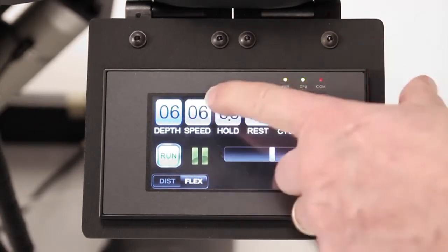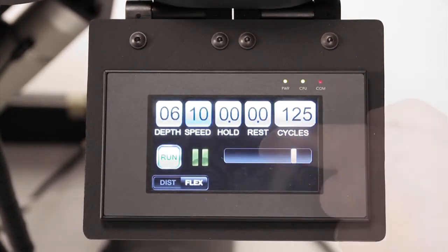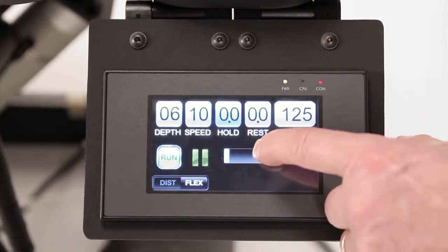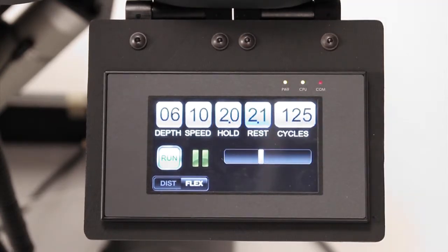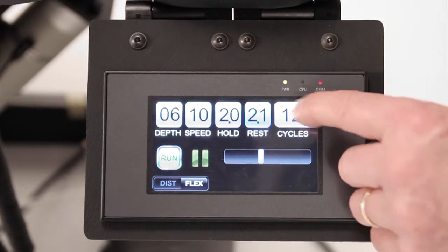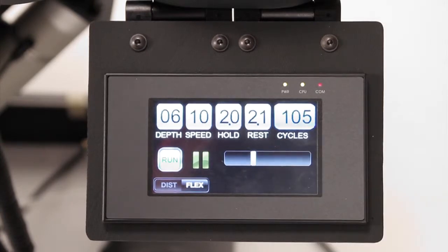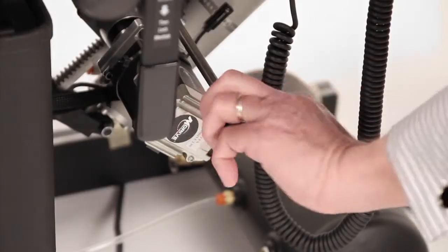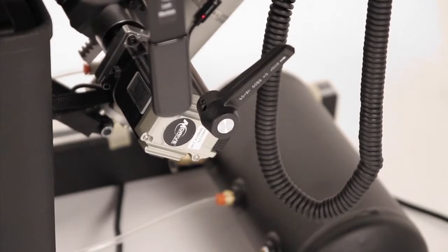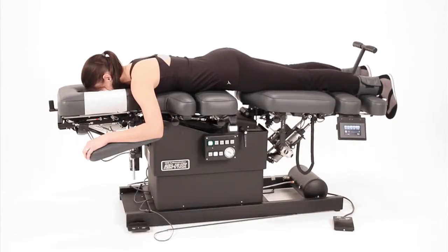Use the touchscreen to adjust your desired settings for flexion depth, speed, flexion hold time, and rest time. You can also adjust the amount of cycles for any given treatment. When all desired settings are entered, touch the green Run button. The Run button will activate the automatic flexion motor. Turn the flexion handle to the 1 o'clock position to start treating with automatic flexion.